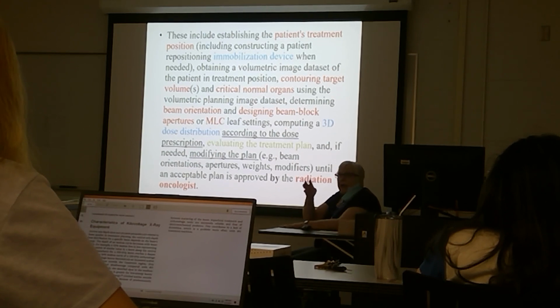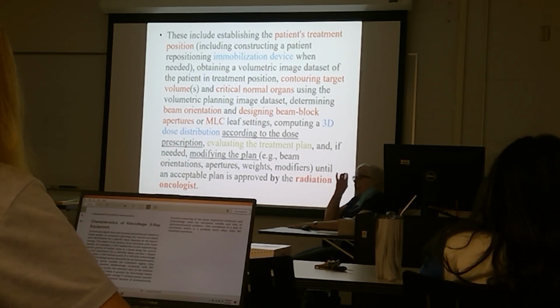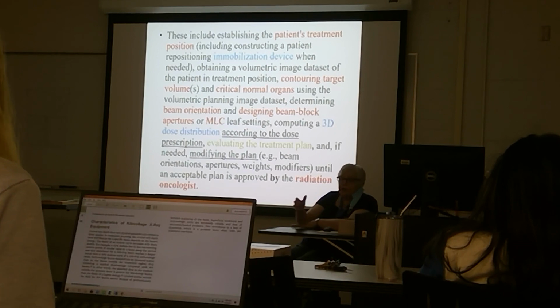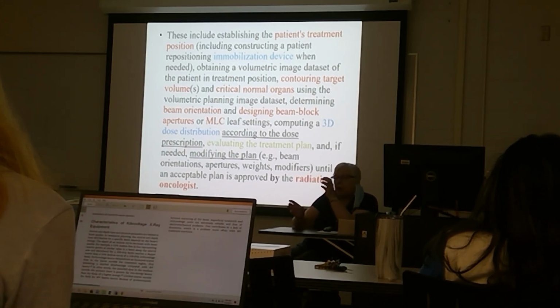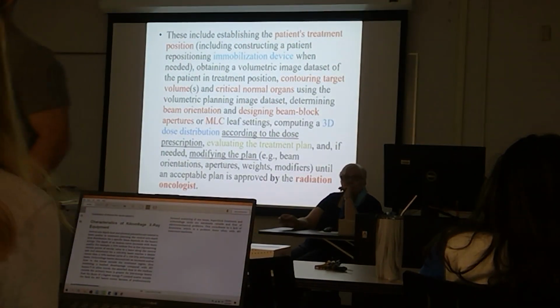So when you get a 3D CT, the doctor will put on the target volume, the PTV. Then he will say, okay, give it back to the dosimetrist and they will do the rest. So he will contour using a computer contouring device to contour critical structures.